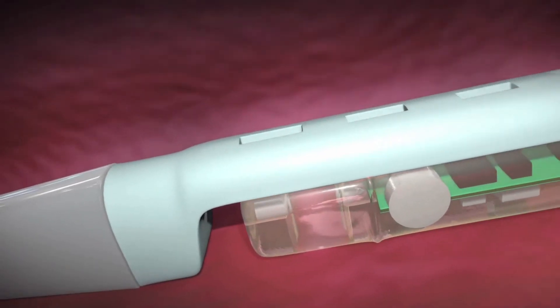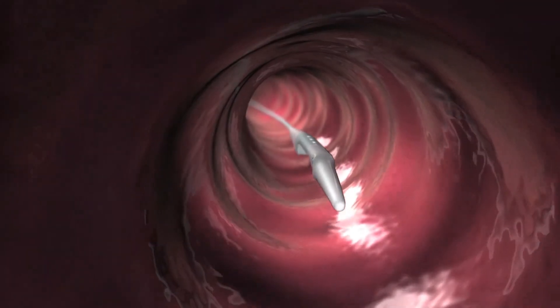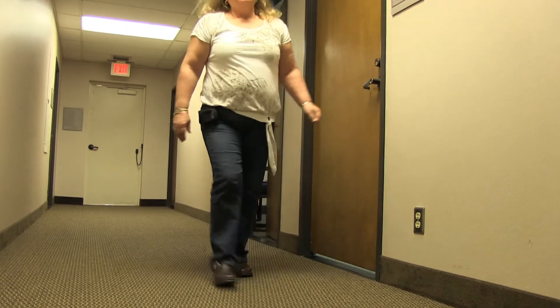The Bravo system involves a pH capsule about the size of a gel cap that is temporarily attached to the wall of the esophagus. The Bravo pH capsule measures pH levels in the esophagus and transmits the data via radio waves to the Bravo receiver worn on your belt or waistband.